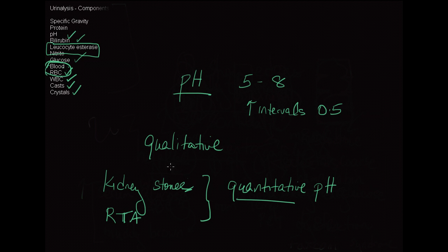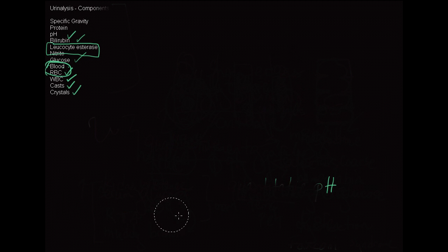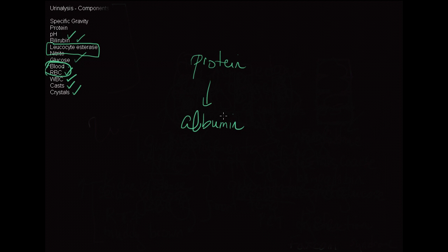The next is proteinuria, and this is another misnomer because many urinalysis tests don't test for protein in the urine per se, but they test for one particular protein, and that's albumin. So what I like to do when I see positive proteinuria, and of course this ranges from 0, 1+, 2+, 3+, and 4+.